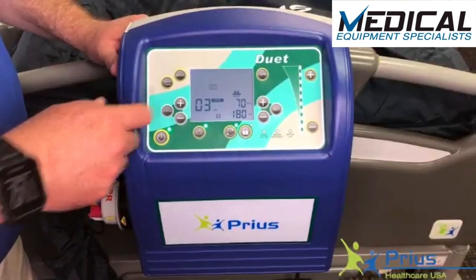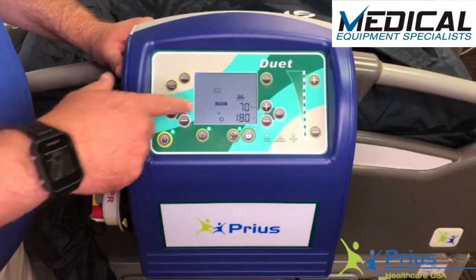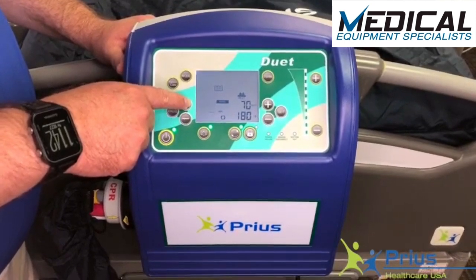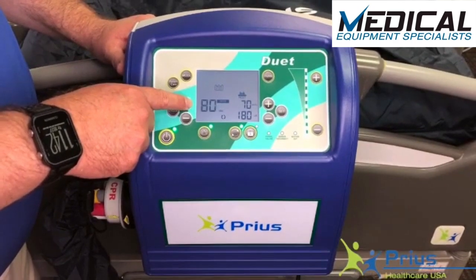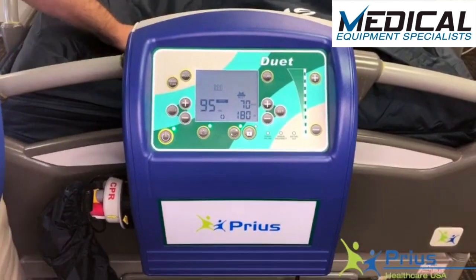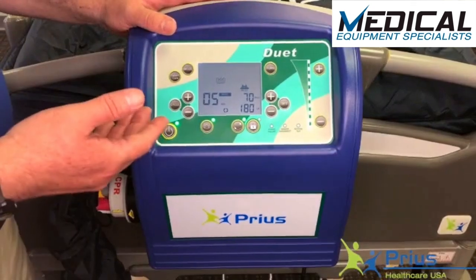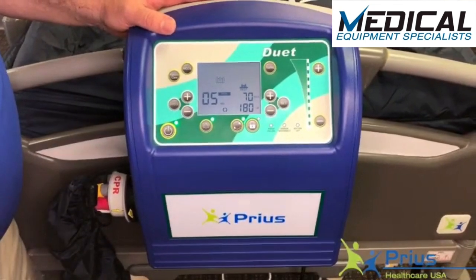Once in alternating pressure mode, we're able to set the amount of time for each phase of the alternating pressure cycle. By hitting the cycle button, you'll see the minutes are blinking. With the plus/minus buttons, you can increase the time per phase in one-minute increments up to 20, then in five-minute increments all the way up to 95. At 95 minutes, the A cells would stay deflated for 95 minutes, then the B cells would deflate after the A cells inflate. A physician should write the order for cycle length; if they don't, we recommend a five-minute alternation cycle.